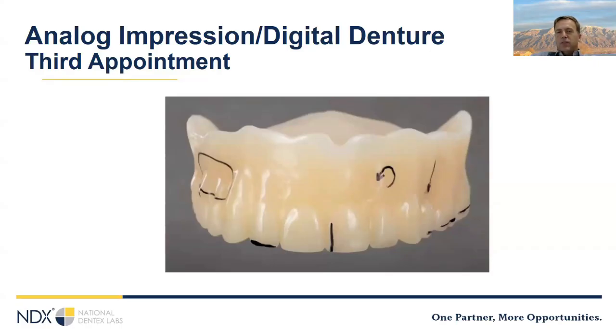Another thing about this is it's obviously not as pretty as the final denture, but it's sturdy enough that you can send it home. So if you would like your patient to do what we sometimes call a test drive, you can make some quick occlusal adjustments if you need them, send the patient to wear it for a few days, and then bring them back and do your adjustments. And if you need to do any assessment, take your photos, that sort of thing.